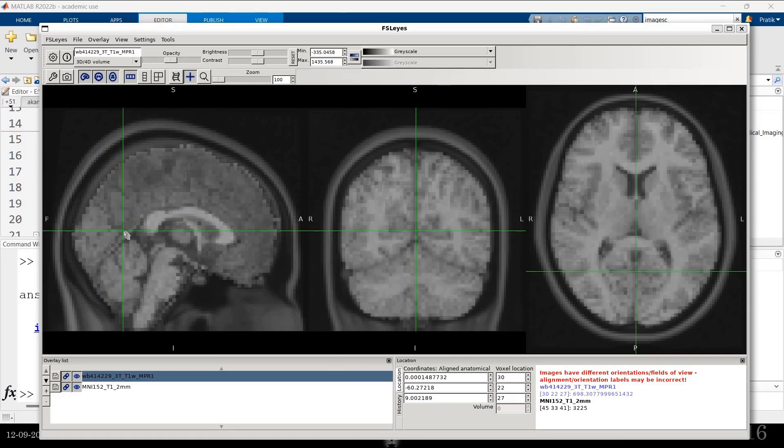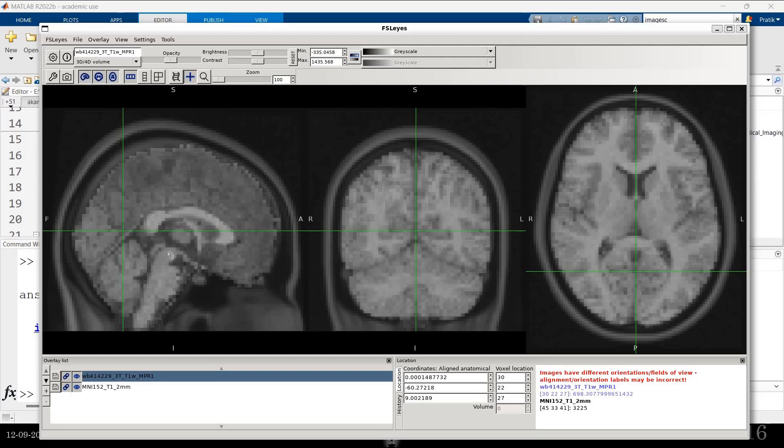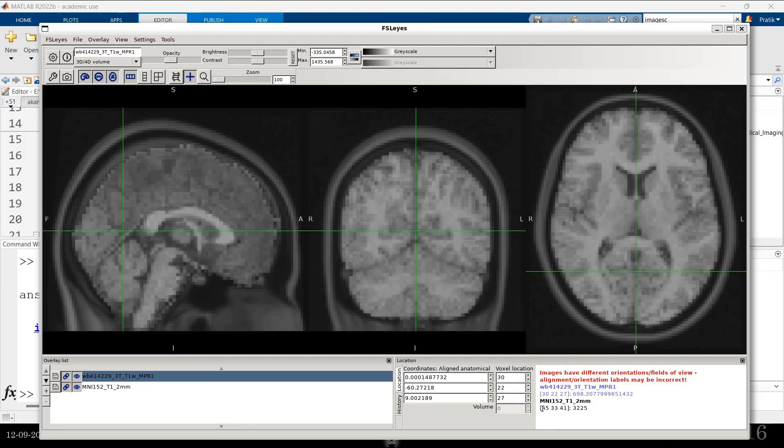There is something called normalization in a toolbox called SPM. Using which you can do this. And you can see that the voxel coordinates for the two are different.